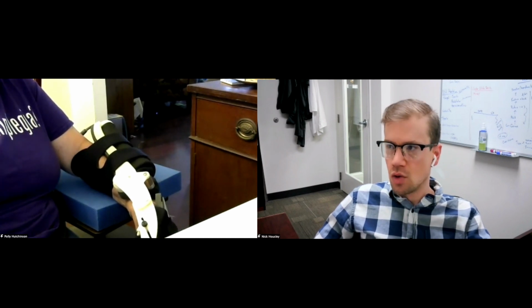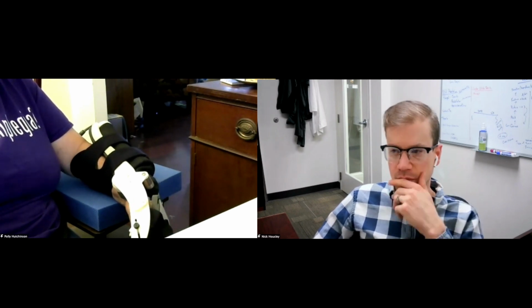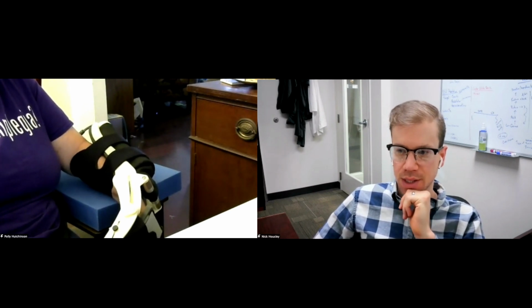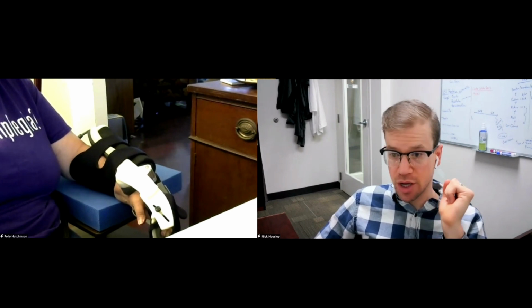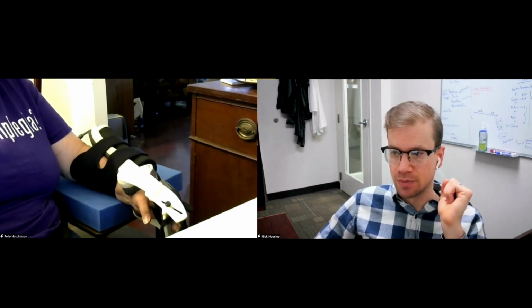Okay. Well, Polly, what are your thoughts here so far? I mean, I know it's going to be hard. It's going to be a little bit of a learning curve, but I'm relatively happy with where we are right now. I think what we might want to do next is, I made that adjustment to your prescription, so Motus Pets is no longer there. And I went ahead and upped the brick breaker and the cosmic tennis time to accommodate for that difference. Is that okay? That's fantastic.